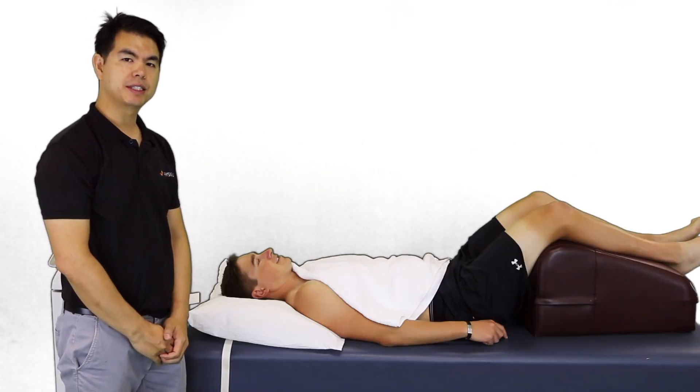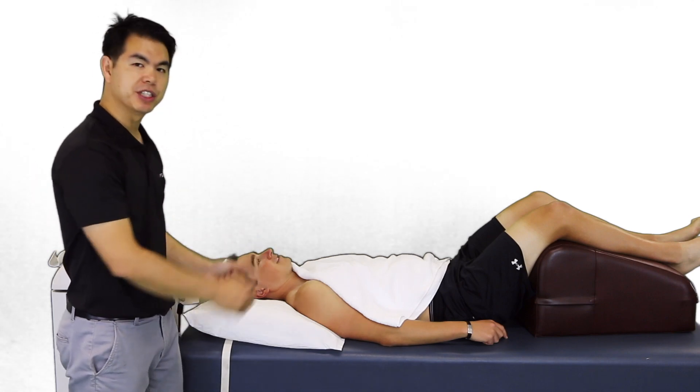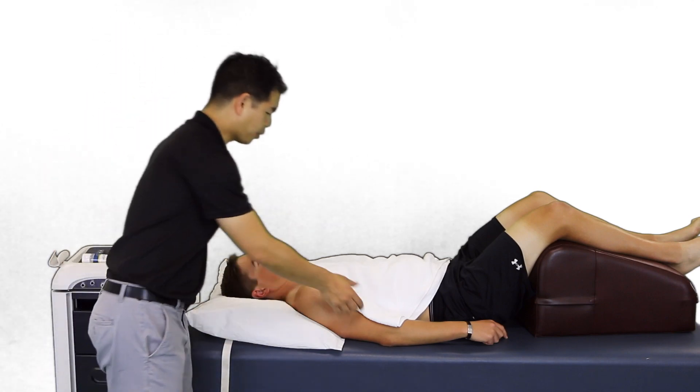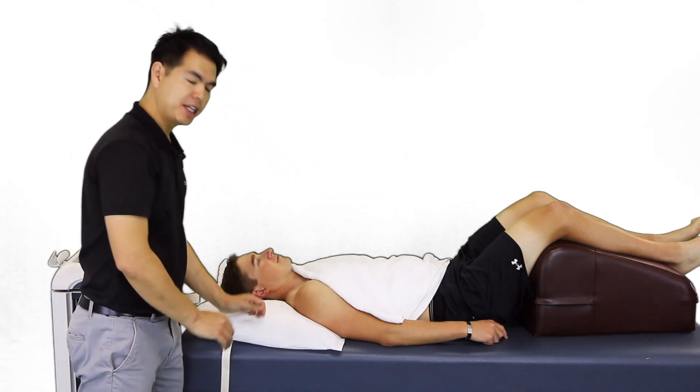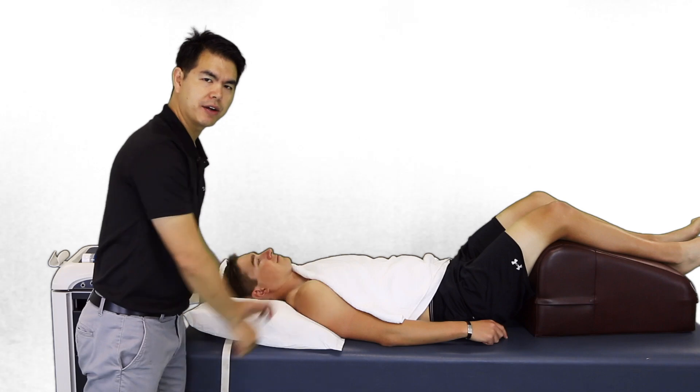For the application of ultrasound, it's important to have the patient in a comfortable position. Ensure that he is appropriately draped, expose the area that you are going to treat, and ensure that there is no jewelry or clothing that occludes the area.